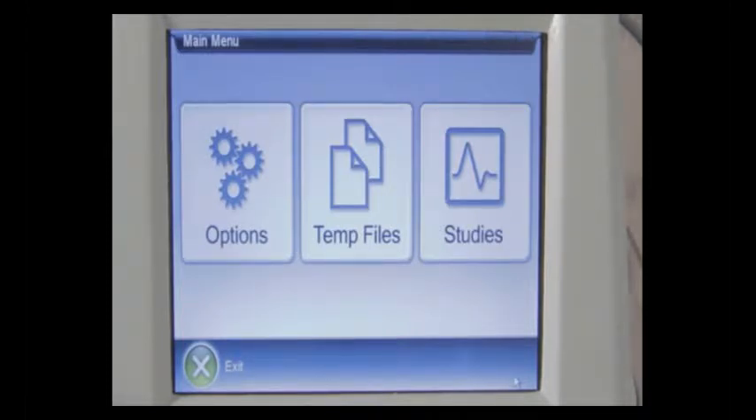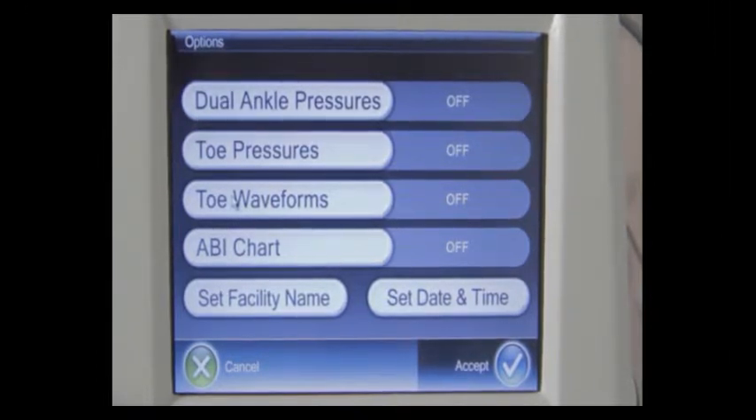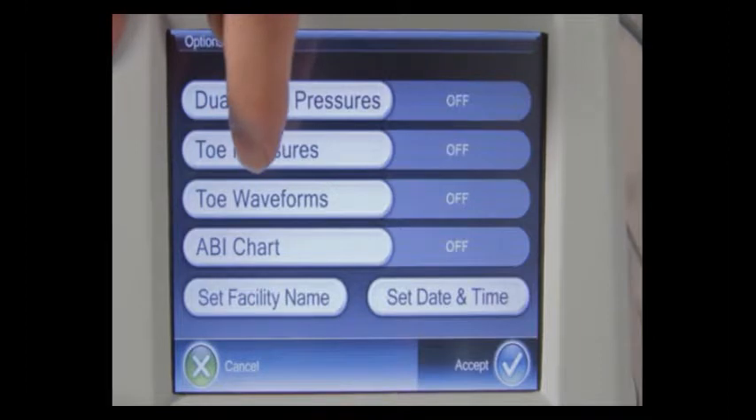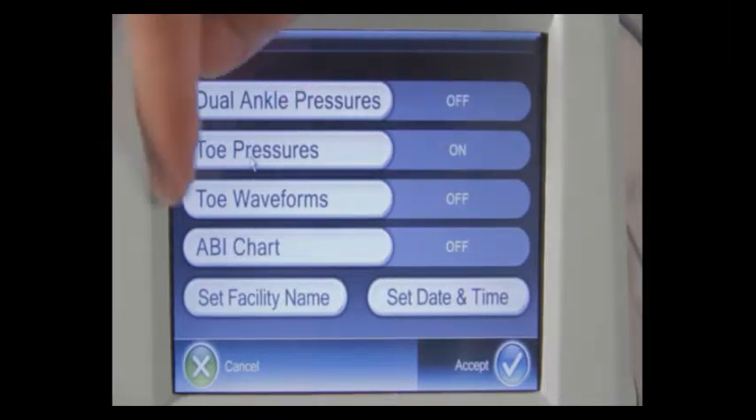Let's talk about the options you can configure for your REVO system. When you press options, you have an option to turn dual ankle pressures on or off. Dual ankle pressures on will allow you to take both ankle pressures simultaneously with the PPG sensors instead of a Doppler. To toggle these options, simply touch the name itself and it will toggle on and off. Toe pressures, if in the on position, will prompt you to obtain toe pressures in the examination. Same with toe waveforms — toe waveforms are currently in the off position, and I'm going to turn them on now.